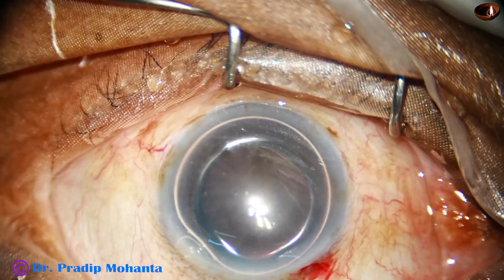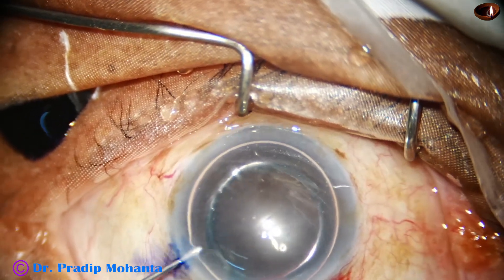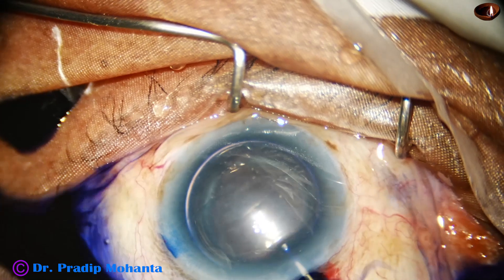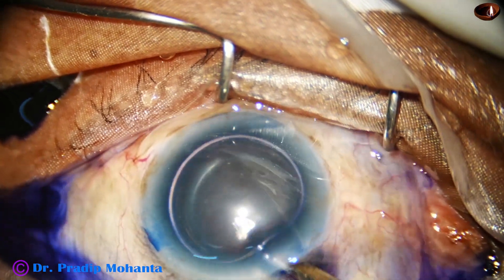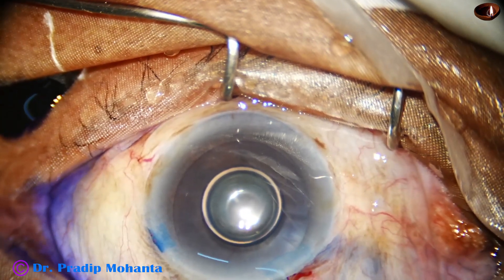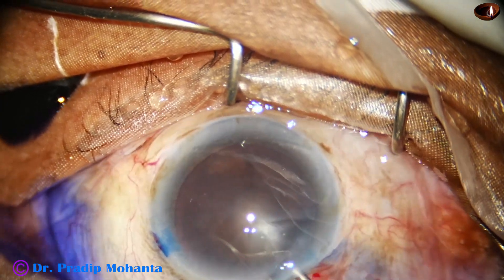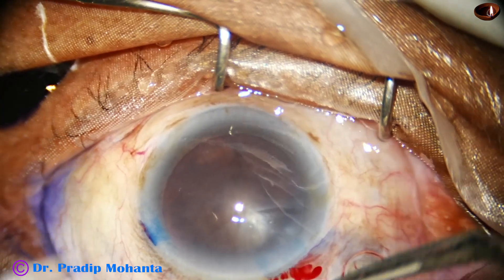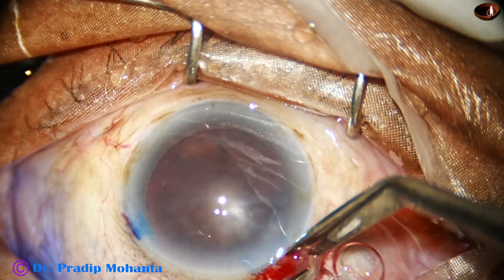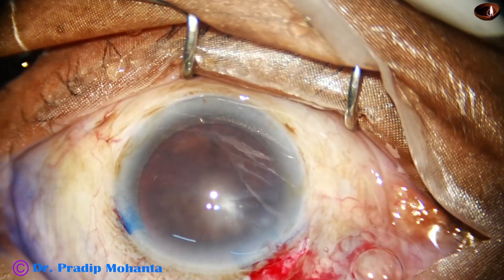An air bubble is injected. Beneath this air bubble, trypan blue dye is applied over the anterior capsule. A little bit of adrenaline is applied, and now the dye is washed out. We have got very nice staining. This is because we have used an air bubble. If we inject trypan blue dye within the aqueous, the dye is diluted — it doesn't sit on the anterior capsule. It spreads all around and the staining takes longer time.